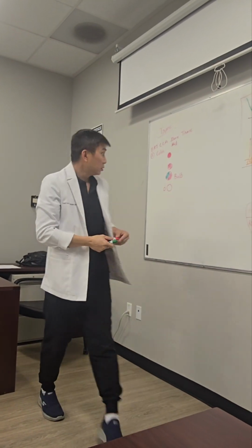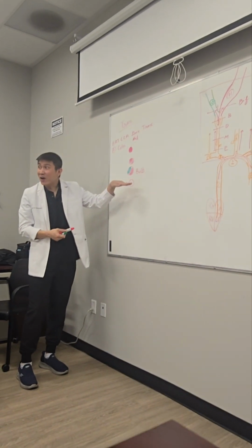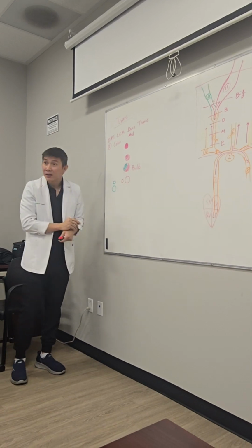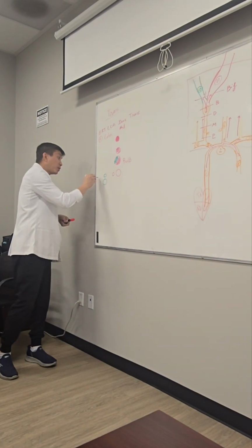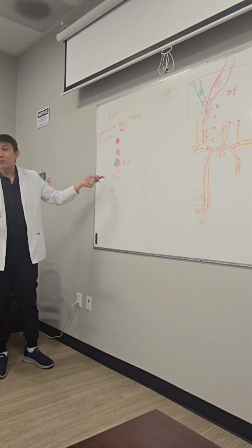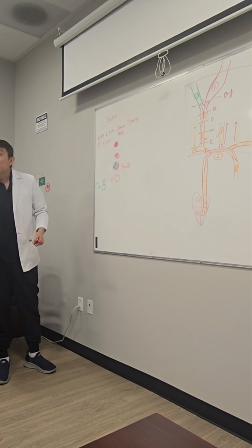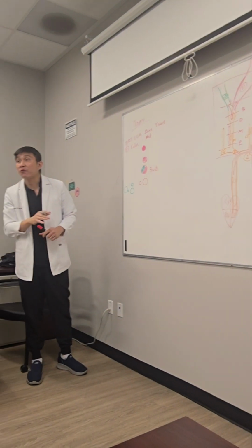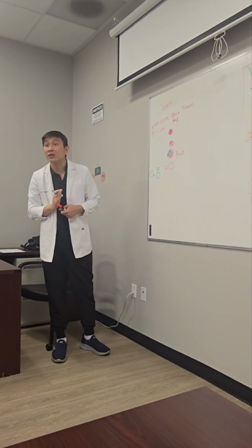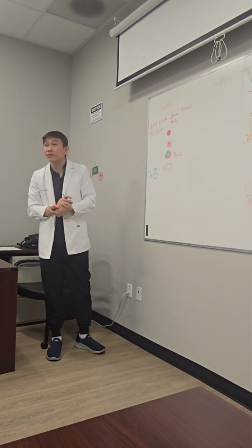So sometimes you scan, you see this. They're horizontal. Sometimes you will see them like this. And sometimes they may switch position. So that's why in the transverse position, we just take them and check for the unequal and the color filling. We don't differentiate between ICA and ECA position. They're a very variable location.